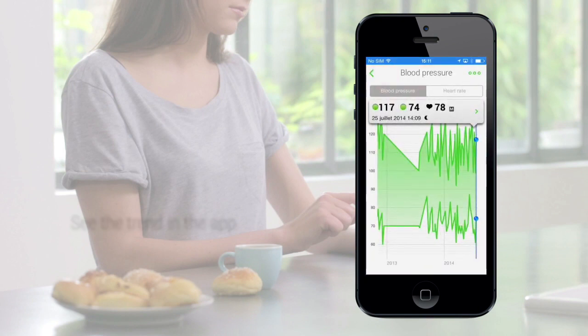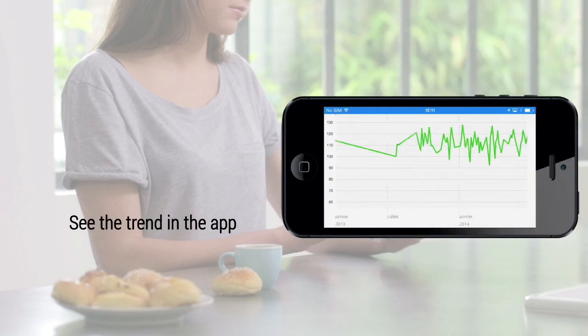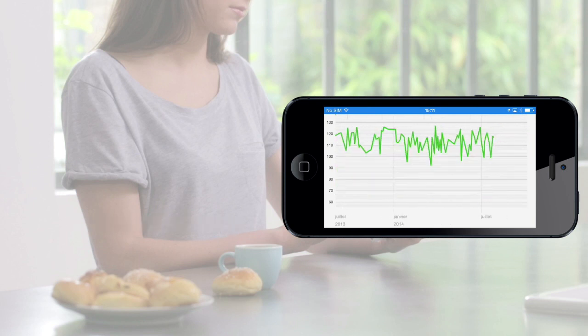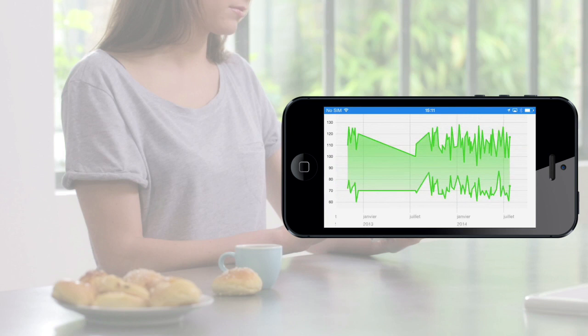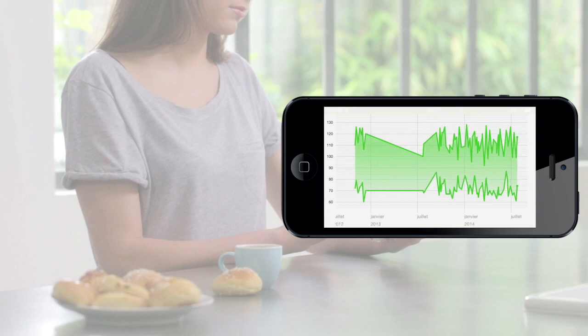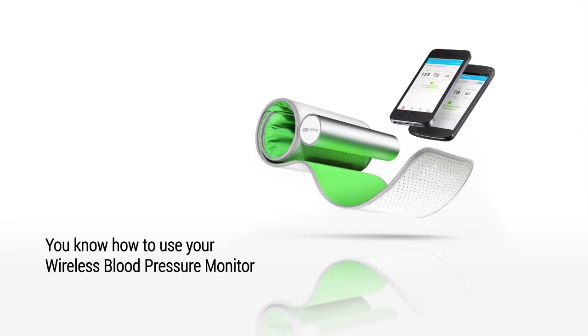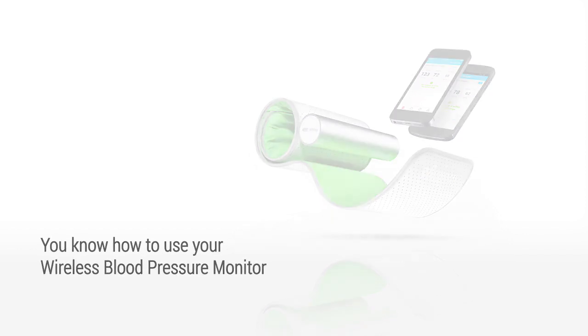You can then see the trends in the Health Mate app. That's it. Congratulations. Now you know how to use your wireless blood pressure monitor.